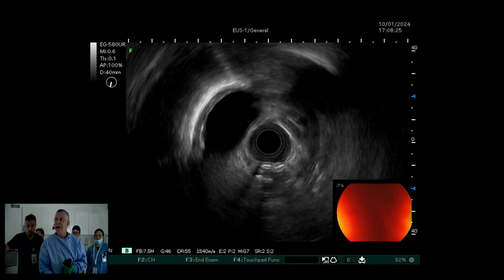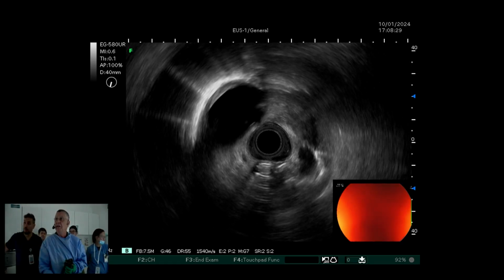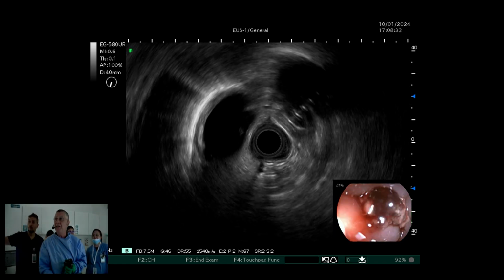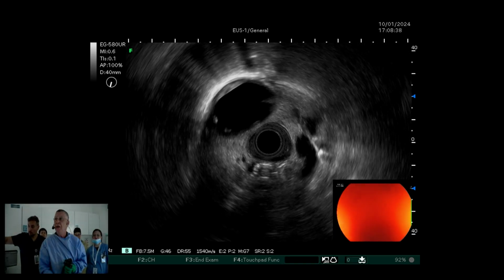In front you have the azygos arch. In front of the aorta, this is the arch. Here it's still the trachea, and now the carina. The carina means that you see two bronchi, and now I push, and they are separated.